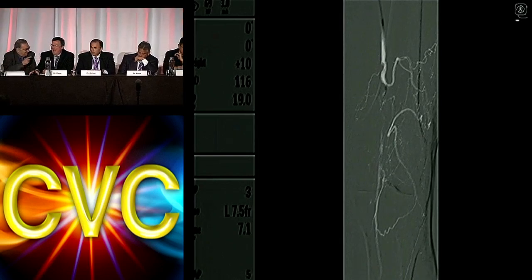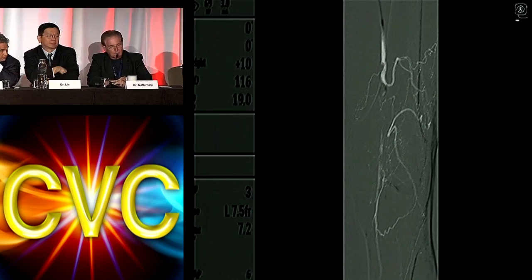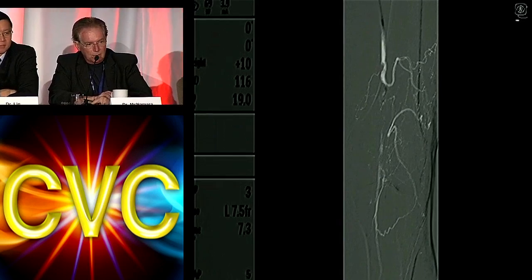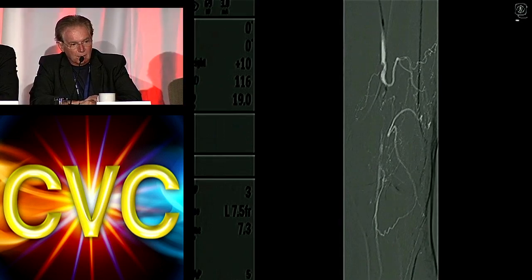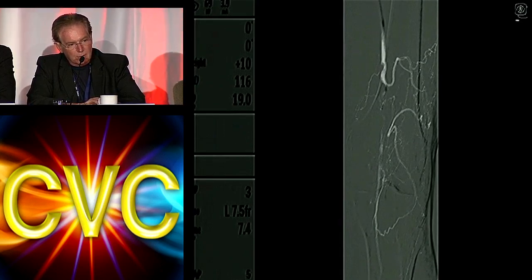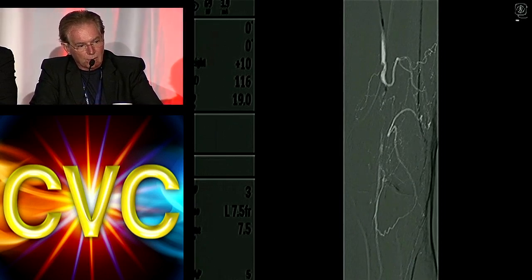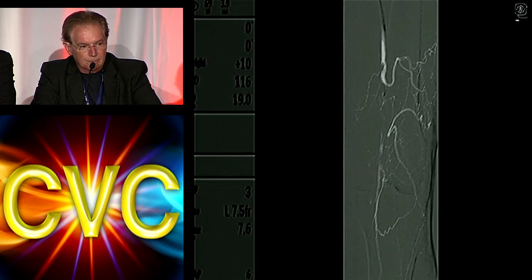Actually, I'd be inclined, after traversing, which might not be easy, but I'm sure Jack will do it, to start with the laser in hopes that some of that is a vaporizable material. If the calcium is due primarily to eccentric, intraluminal calcified plaque, that's a much harder problem. I think the laser would help clarify whether that is really what you have to ultimately deal with.